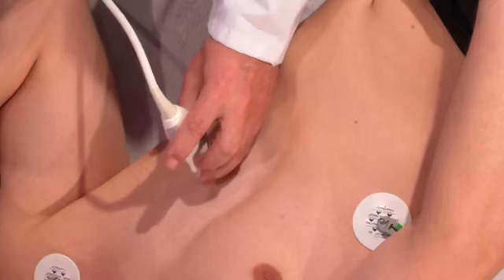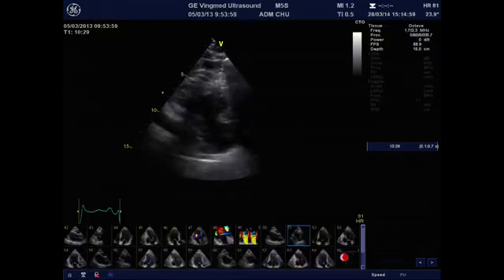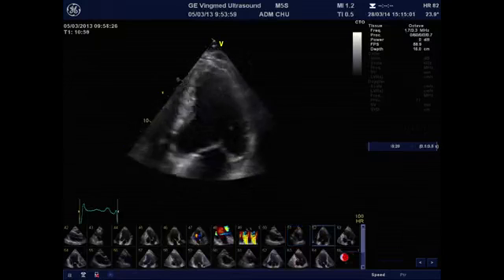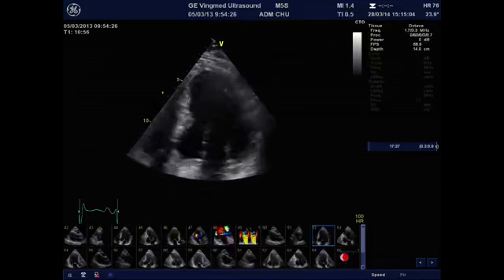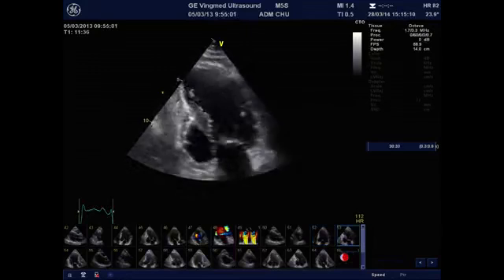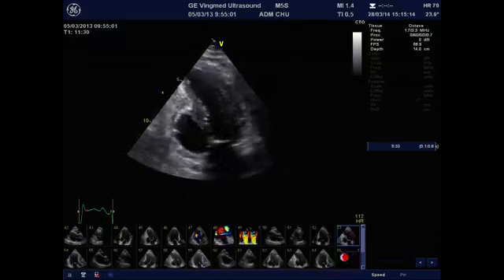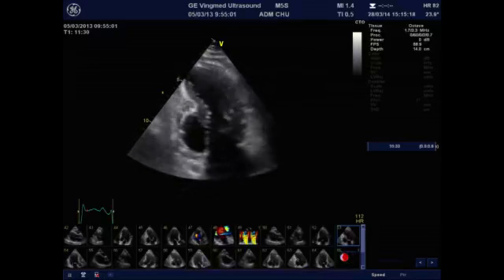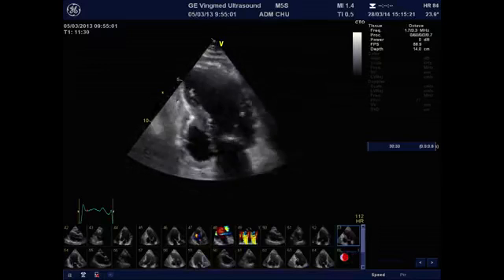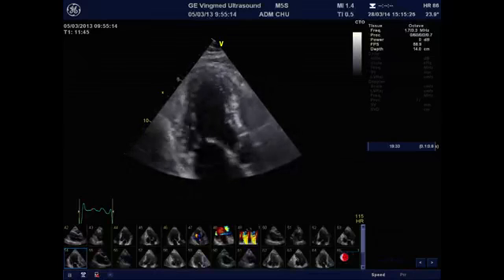So here we have a heart rate of 86, and we will take the long axis view, the short axis view, and again the apical 4-chamber and 2-chamber views. It's clear that there is some improvement in myocardial thickening of the anterior wall. Of course, no change in the inferior wall, which represents a transmural complete myocardial infarction. And this is the apical long axis view.